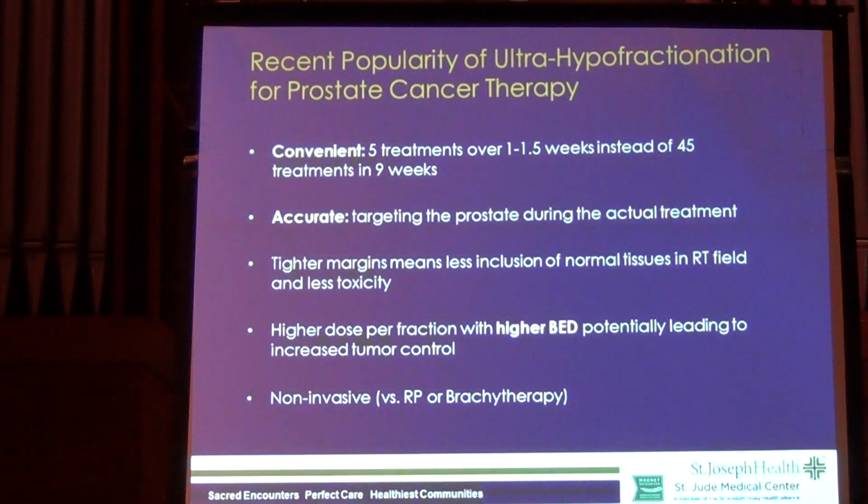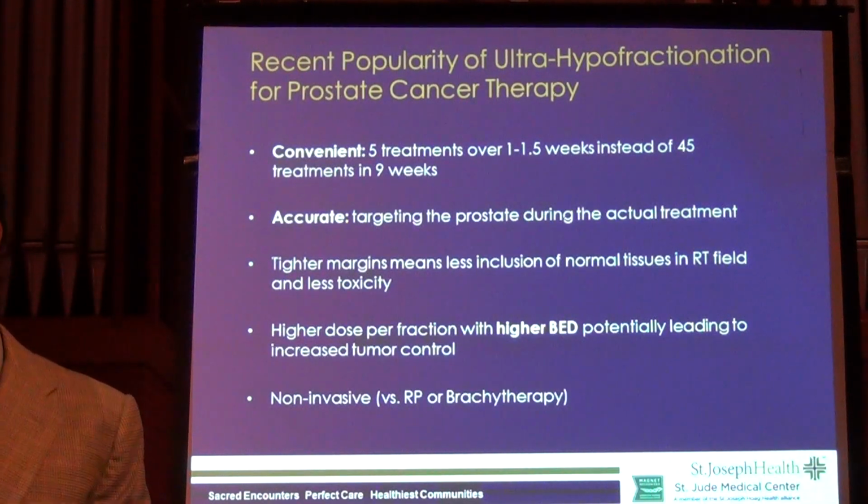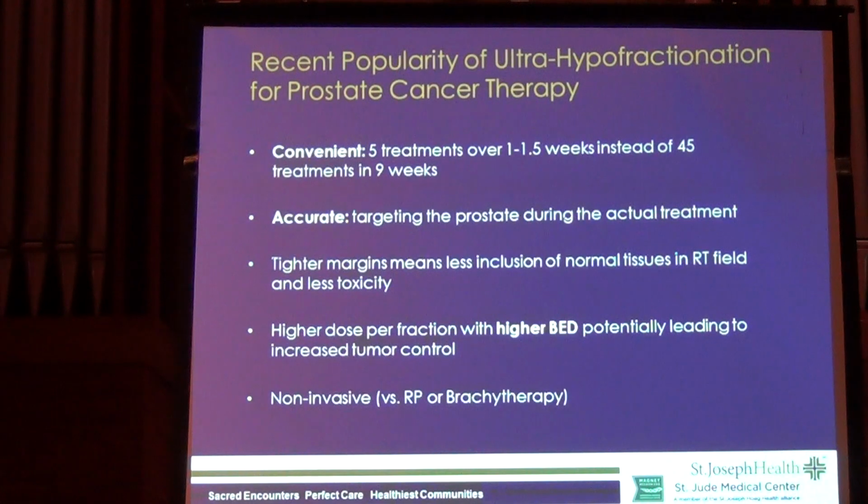It's accurate. It's very, very technologically driven, and there's a lot of planning that goes into making this very precise. We can give a higher dose per treatment, and that higher dose doesn't just shorten the treatment time. It takes advantage of the tumor's biology, and we're actually getting better results by going quicker. So we're not just getting the treatment done faster, although it is more convenient. It's actually been shown to be more effective.